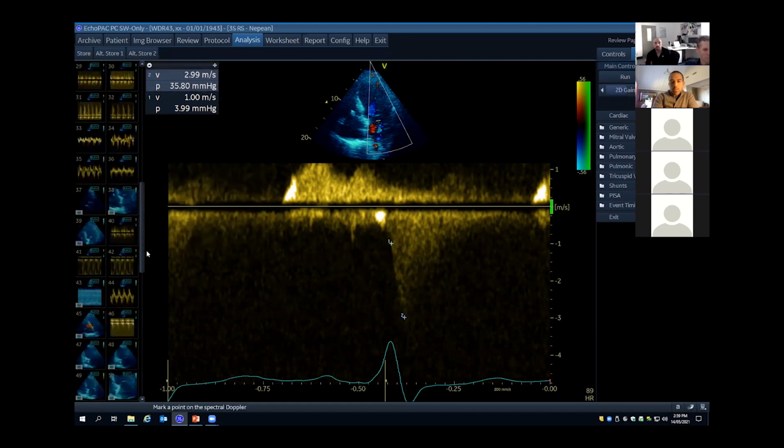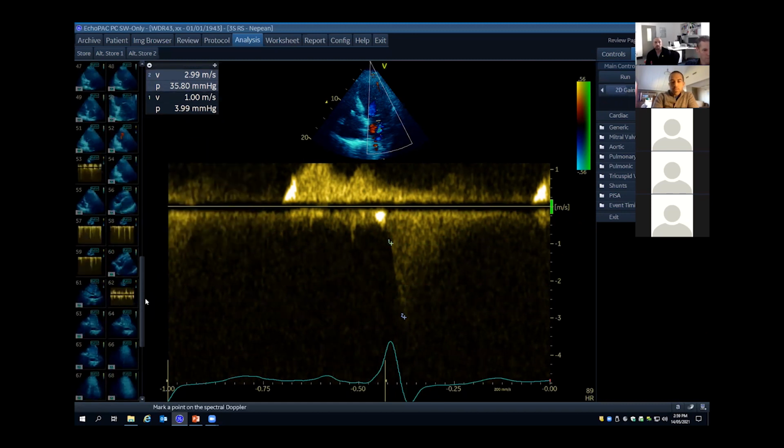I guess the other thing, if I was interested in left atrial pressure with an MR trace, although it's usually easier if it's central rather than eccentric, is getting the Vmax and doing a simplified Bernoulli equation on that.